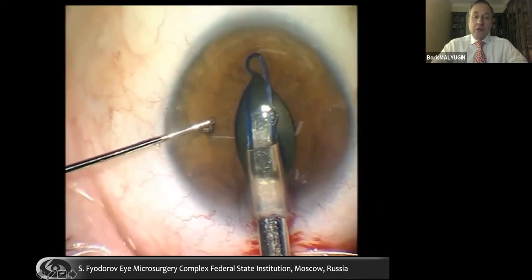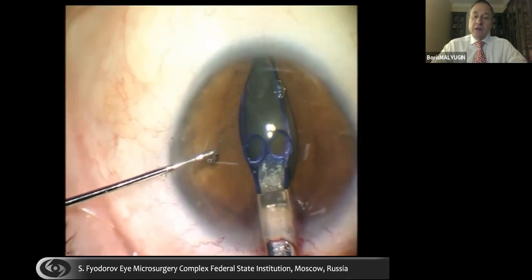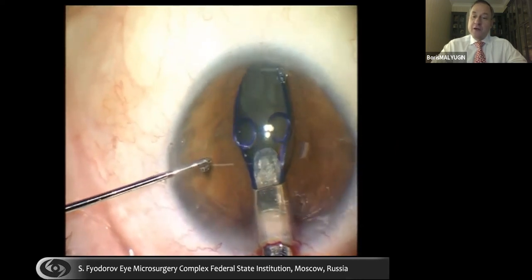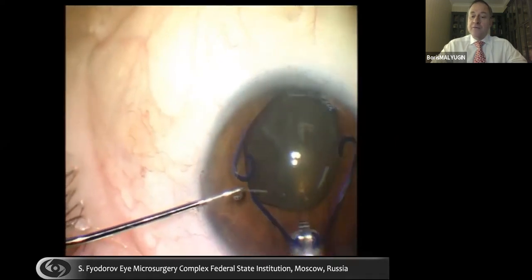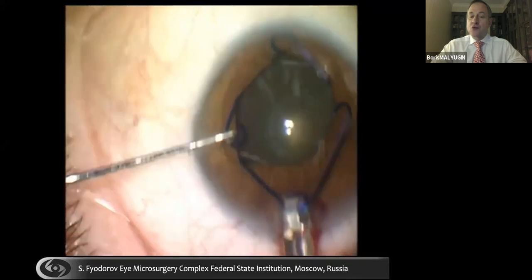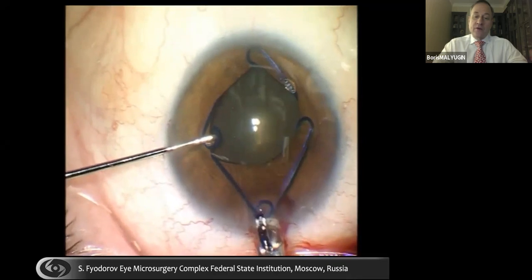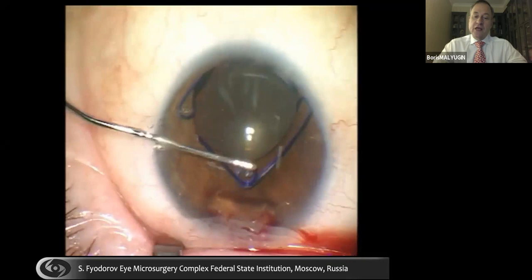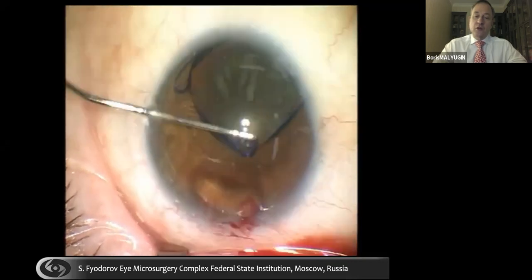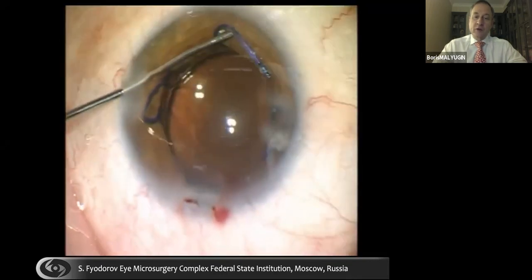As shown here, this is the injection process, and the ring expels from the injection device, and at the same point catches the distal and 2 side scrolls with the iris. And then what you need to do is to engage the last scroll, the proximal scroll, which is located closer to the main incision, and then place the device properly and center it.